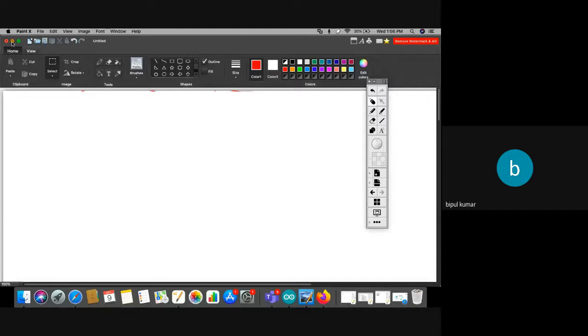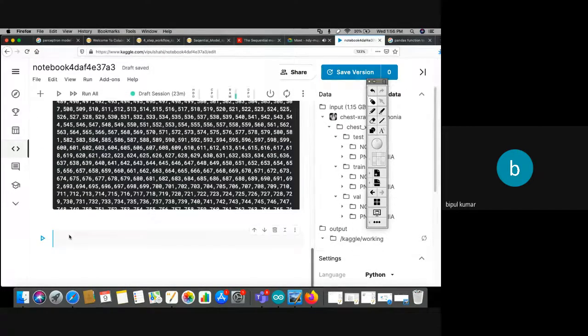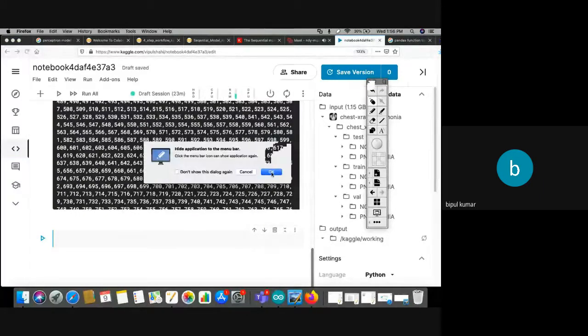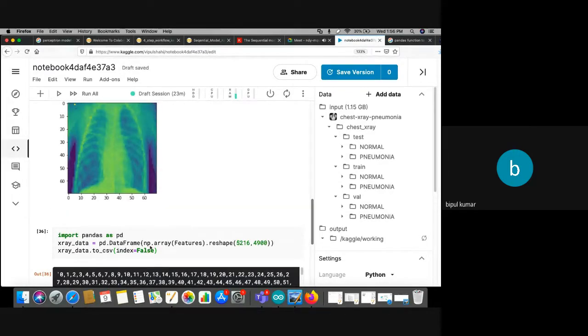I hope it is done. It is stuck actually. Just a minute. Why is it not performing anything?